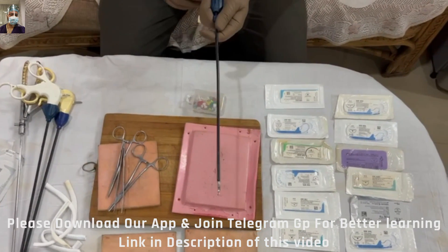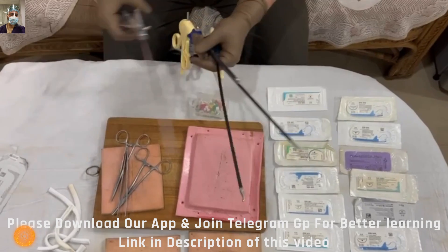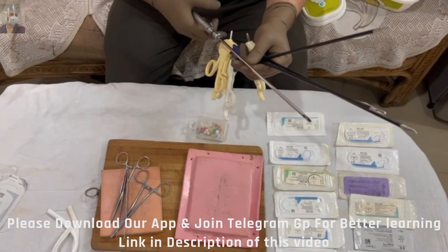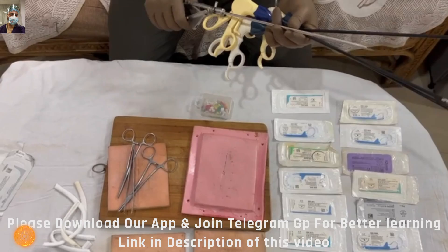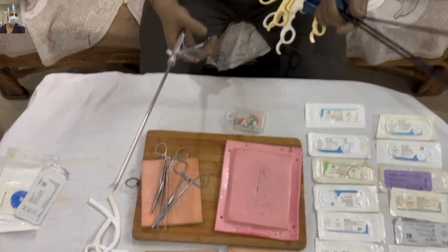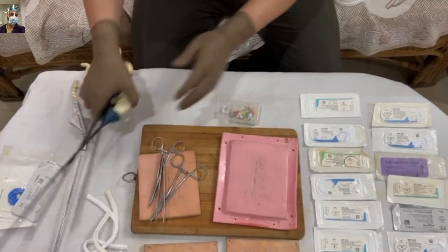Some instruments here are for advanced suturing techniques — lap needle holder, lap grasper, scissors, and Maryland forceps. When I tell my trainees about these, they are a little hesitant, but just compare the cost of these things against one pair of branded jeans or compare it to the cost of your mobile. These are not very costly, and we are investing in our future and in better patient outcomes. Arrange these things — it's not difficult.